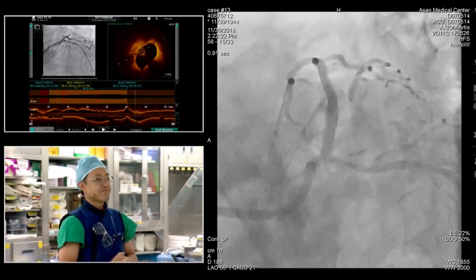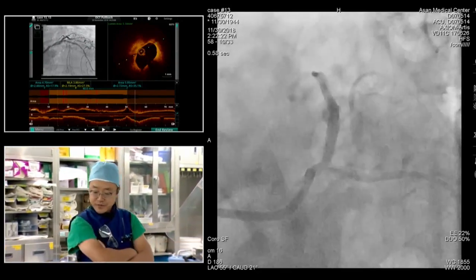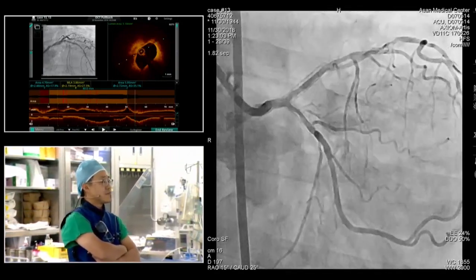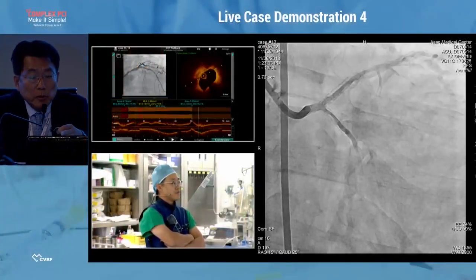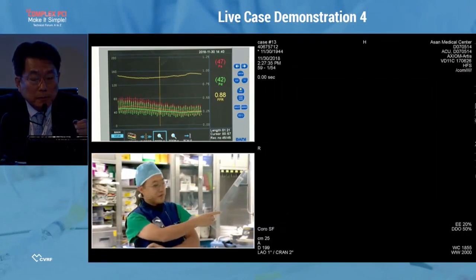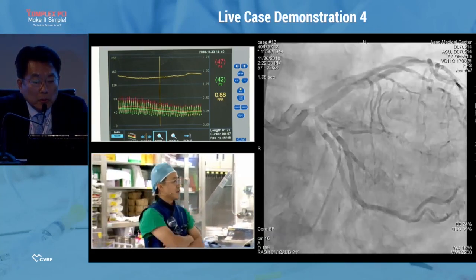Great. Would you show us a previous view? I have a question. The previous view. Previous. All right, the array coral view. No, previous. All right. Great. So I think this is not before treatment. This is the original one. The last picture, that is the last one. This is the last picture, before. This is the first one. Okay, got it. Great, that one.